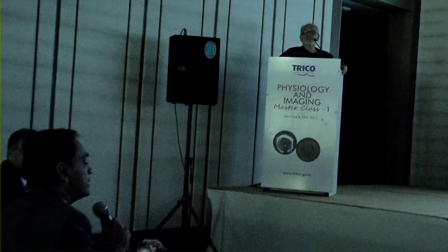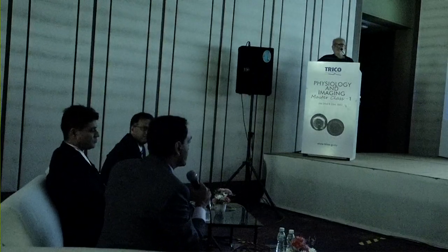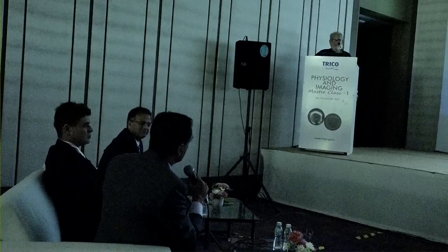Dr. Prasad, I think you're the first person I've heard who's learned OCT before IVUS. That's quite a unique position to be in. But most of us who learn IVUS first, it's really about comfort. I think both are fine. There are a few nuances, like large vessels and contrast load. But otherwise, it's really whatever you're comfortable with. You're right, OCT shows you things you will never see with IVUS, although HD IVUS is getting close in some ways, but not really the same. So whatever you're comfortable with and get really good at and use all the time is the key, rather than which one.